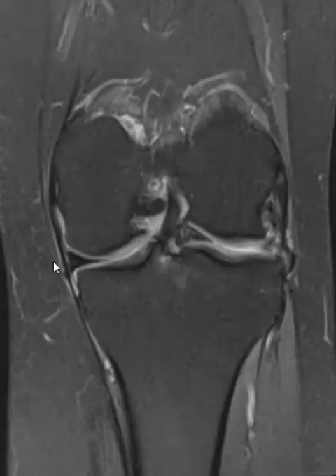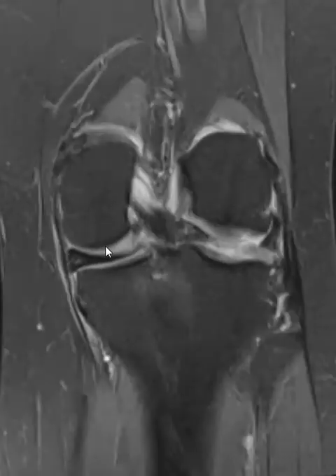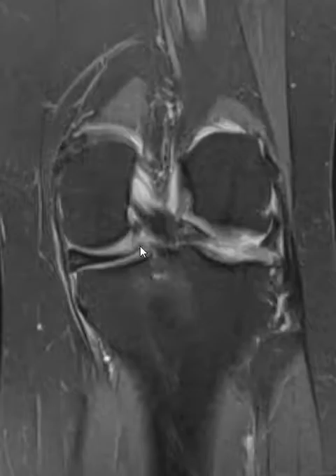And right now the meniscus is not pseudo-extruded, but with time this will go out, and then it'll cause abnormal stress on the medial side. And often you see marrow signal changes, but again, this one must be recent, and we see the separation, but we don't see any of the other changes yet.